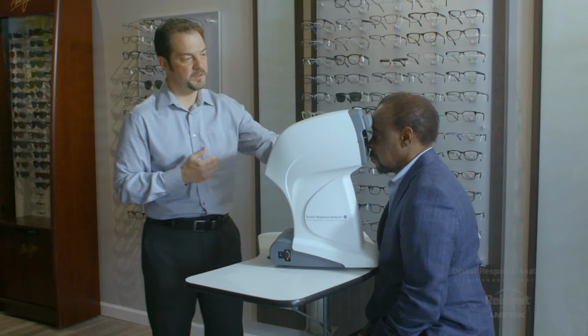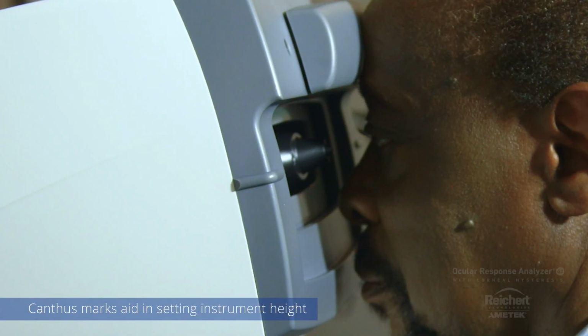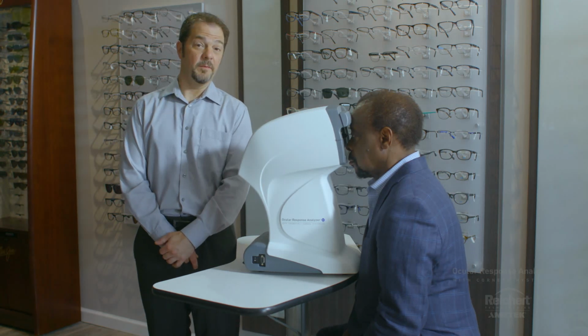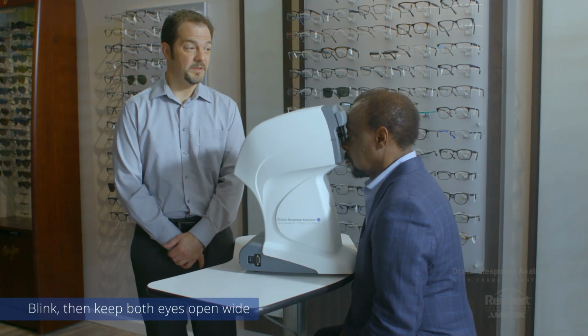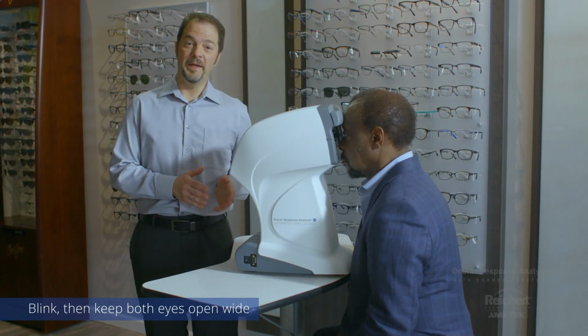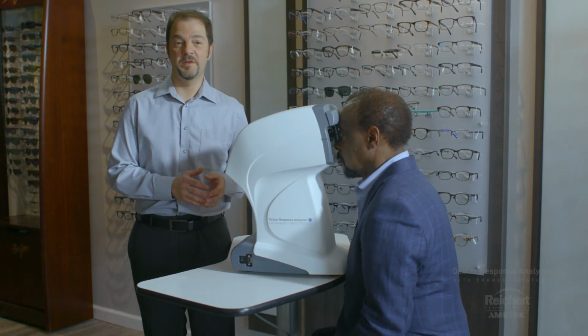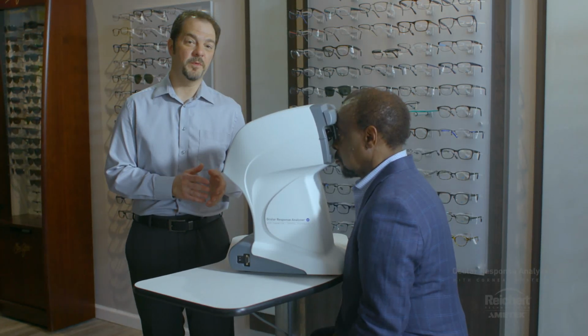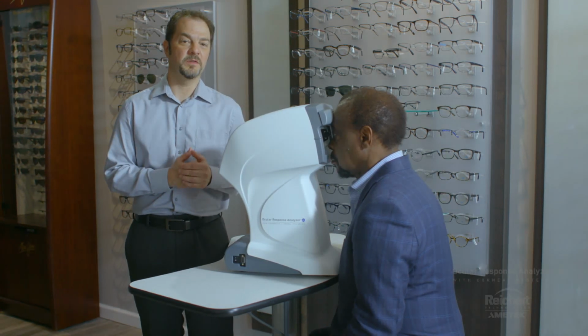There's some canthus marks here on the side that should help you make sure that the instrument is at the proper height. So when you're ready to make a measurement, I ask the patient to blink a few times, keep both eyes open wide, and then I press the measure button. Now, blinking helps to make sure that there is a nice glossy coat of tear film on the corneas, which is helpful for the measurement process, and keeping both eyes open is also helpful so that the patient doesn't squint.